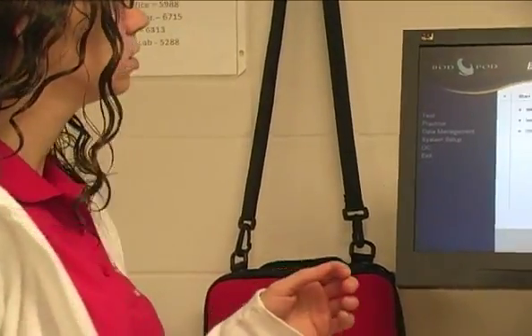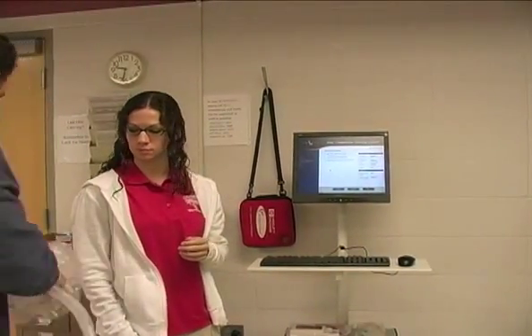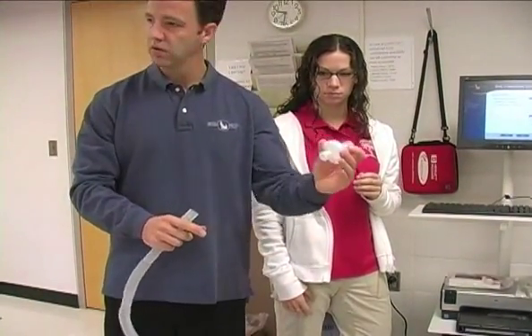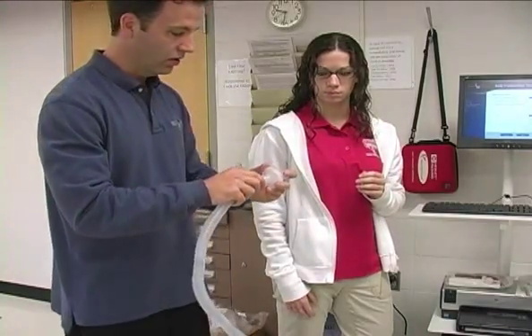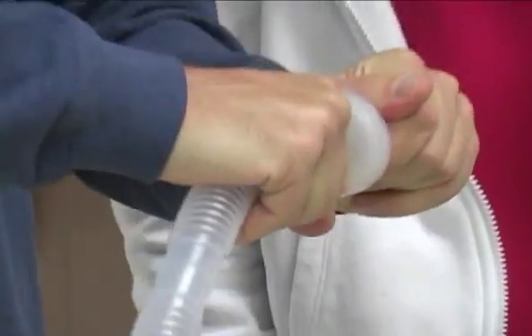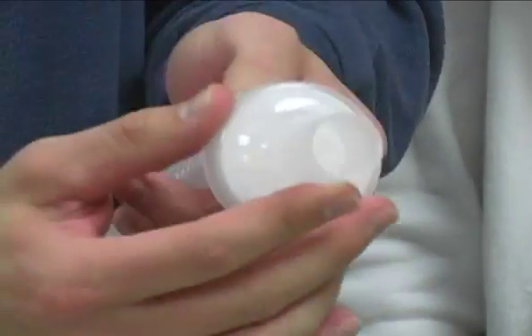Make sure it's empty, install the tube and filter. This is used to measure the lung volume. It doesn't matter which end of the tube you plug in here, but it does matter what end of the filter. So, what you want to do is just attach it to the smaller end of the filter, and just so it's snug. Some people ask, do I have to push it all the way there? If you do, I'll give you a prize. 'Cause I don't know. So just so it's snug and tight, so there's no leak.